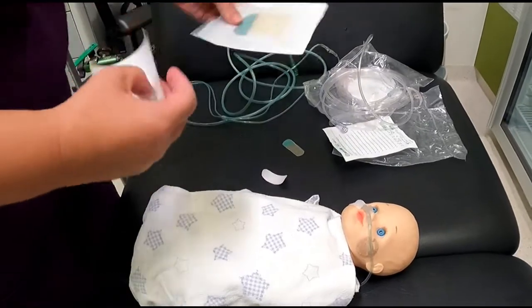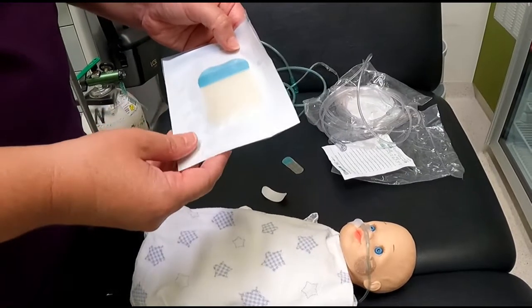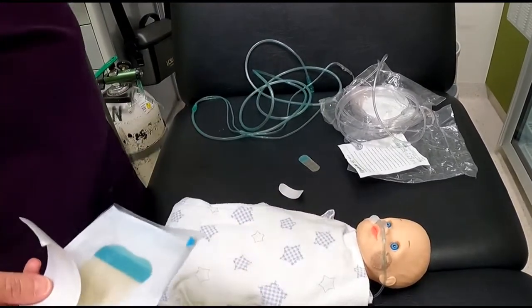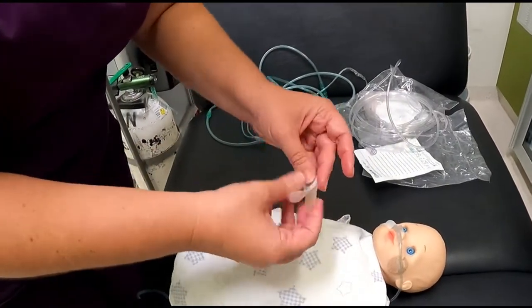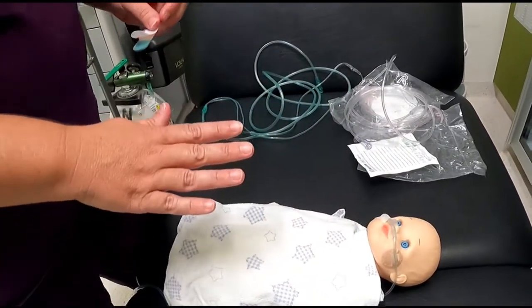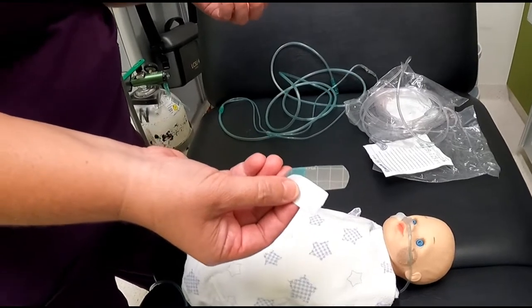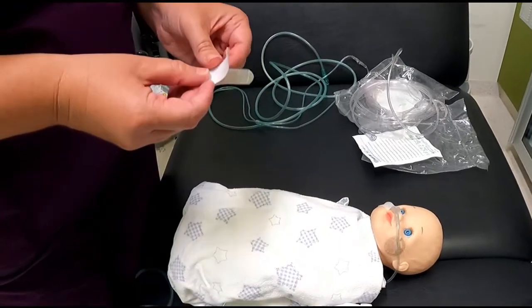So after you've washed your hands, just make sure you've got everything ready. You'll get a supply of the Comfeel, which is the nice soft tape that goes on your baby's face, and the Fixomull, which is the one that holds the oxygen tubing on. So I always get my helper to stand behind. Make sure that you've pre-cut out your tapes to your baby's face size. One thing that is a good thing to do is when you get home, just pre-cut out a few templates, because you'll find if your baby pulls their prongs out in the middle of the night, you don't want to be trying to find tape and cut it up. So just make sure you've always got everything ready to go.